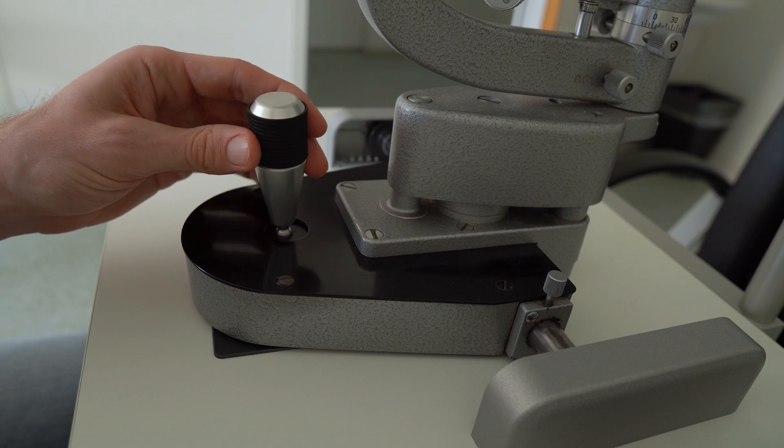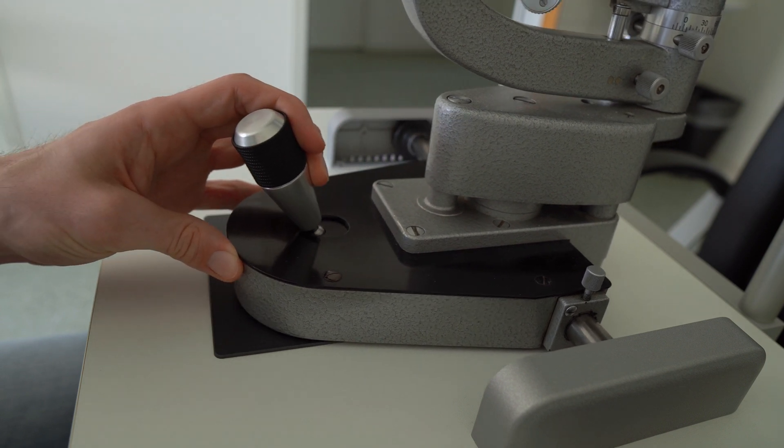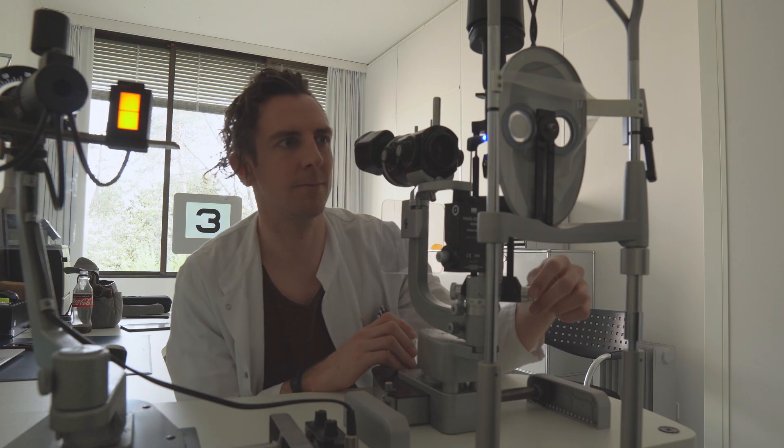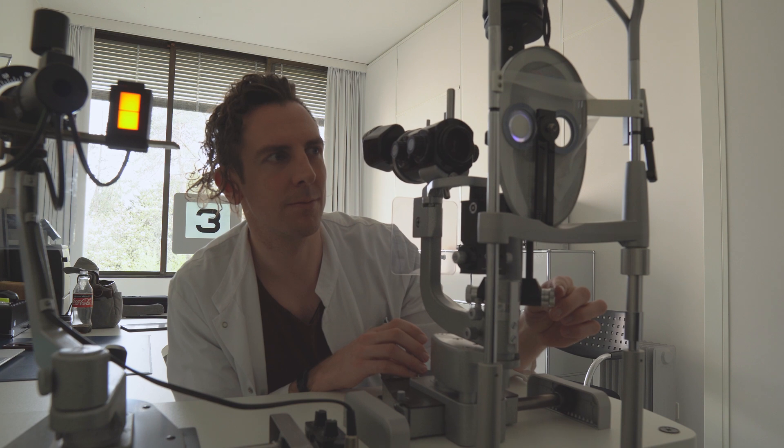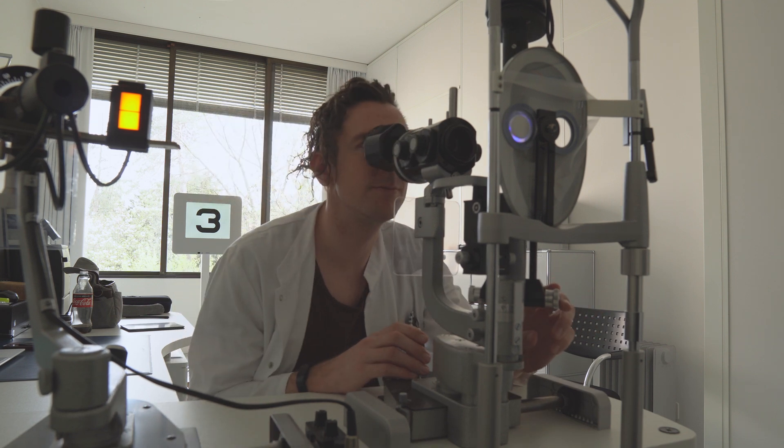Next, put the joystick of your slit lamp all the way back and slide the whole slit lamp forward toward the patient very slowly, while looking at the patient from the side — not through the slit lamp. Once you're fairly close, switch back to your eyepieces. From now on, only use the joystick to move back and forth.